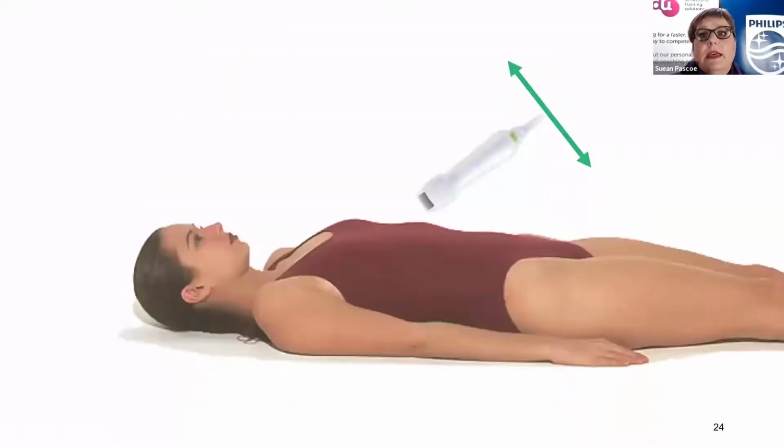The other thing is just play with the tilt on your probe in this direction to try to figure out where is that longer view, where you can see the heart the best. The angle of the probe at this point is quite variable for lots of different people, and sometimes it can even be quite flat on the stomach almost.